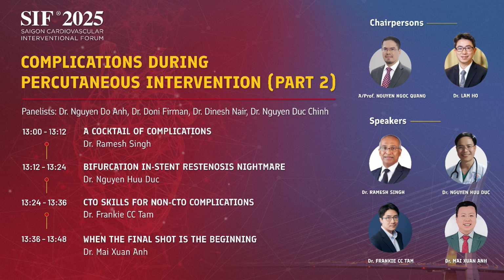Just curious. I'm not asking about the technique. You are really great, you did a great job. Among patients with low ejection fraction and akinetic segments like that, the REVIVED-BCIS2 trial showed there is no benefit to revascularization in this kind of patient. So what is the consideration?